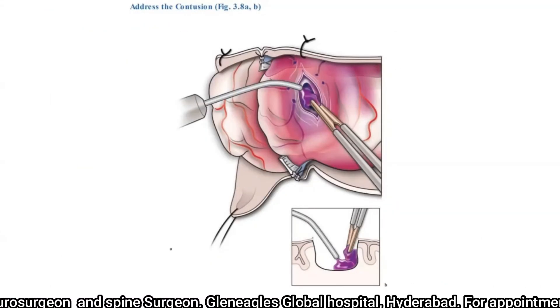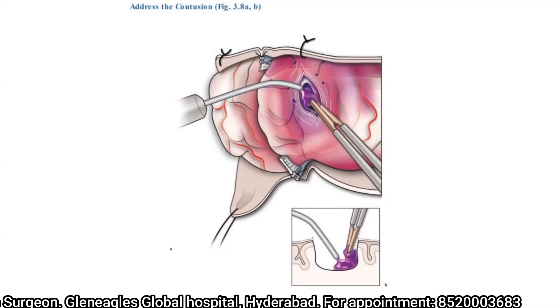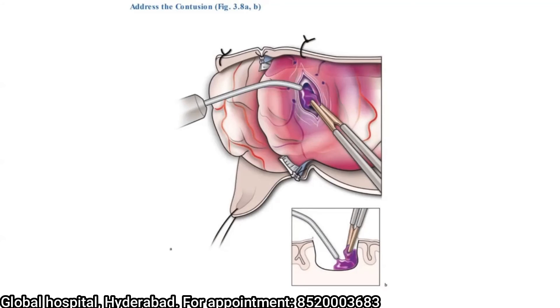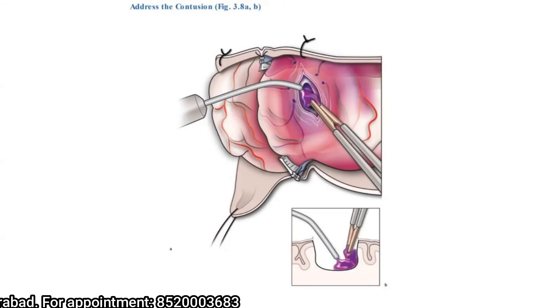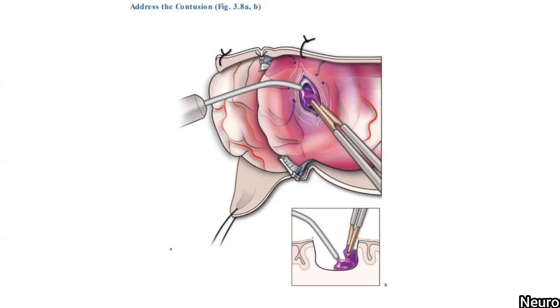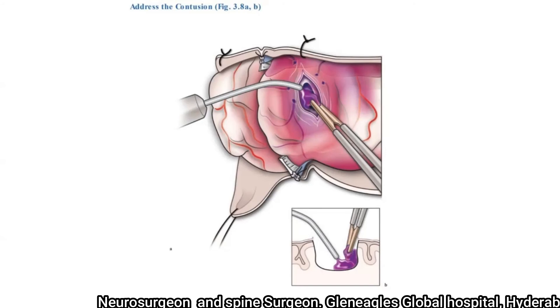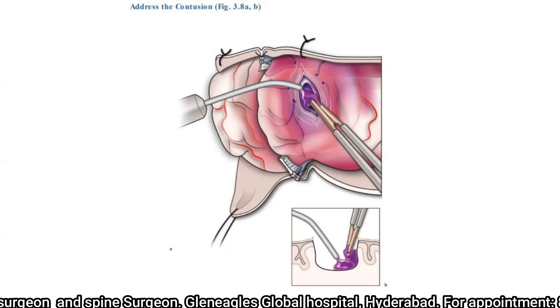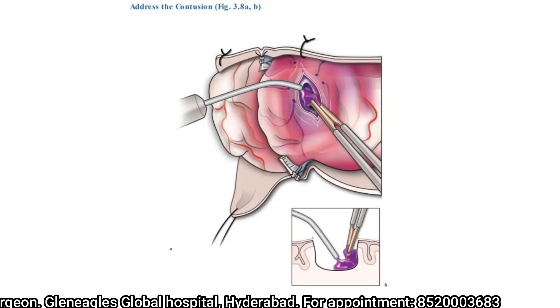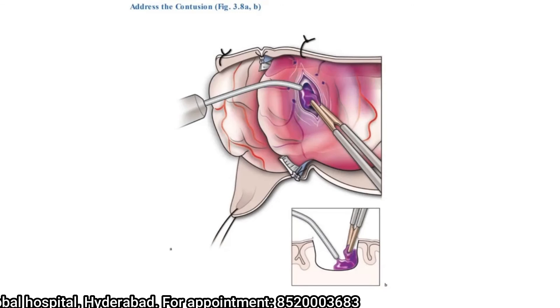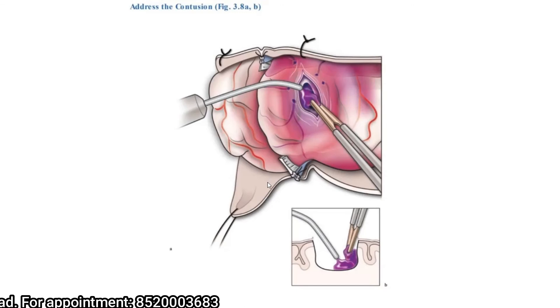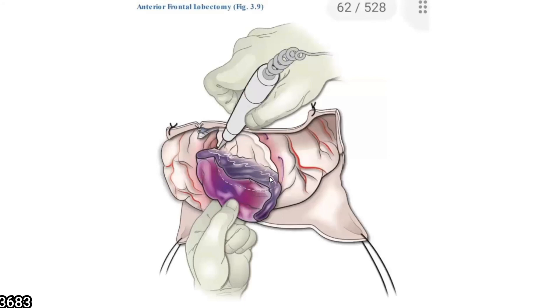Evacuation of the contusion is similar to the technique described in the previous session — viewers are encouraged to review that session on the YouTube channel. The steps involve: identification of the contusion, cauterization of the superficial pial surface, working in the sub-pial plane to reach the contusion, then evacuating the liquefied components of the contusion, and achieving hemostasis.